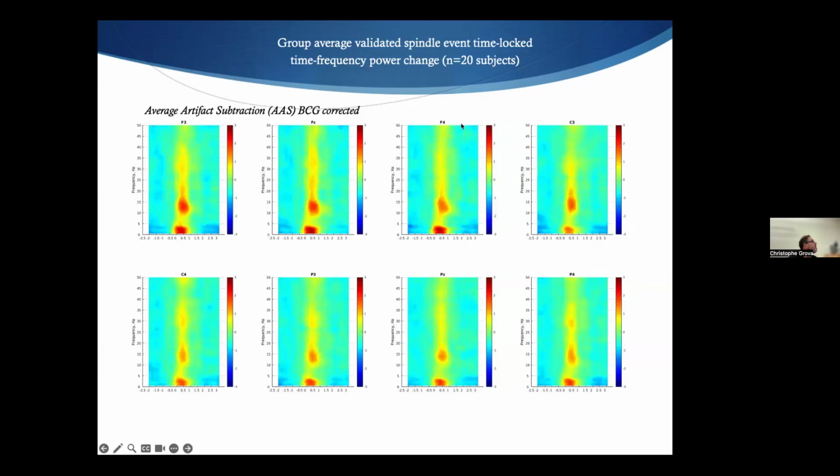So here for a few electrodes, you have time frequency representations. And you see here, when you apply the AAS method to correct the ballistocardiogram, we still see some remaining artifact over there, but we see mainly a nice peak here between 10 to 15 hertz. So we are more or less in the spindle range. So this was considered as okay. This is a group level change at 20 subjects.